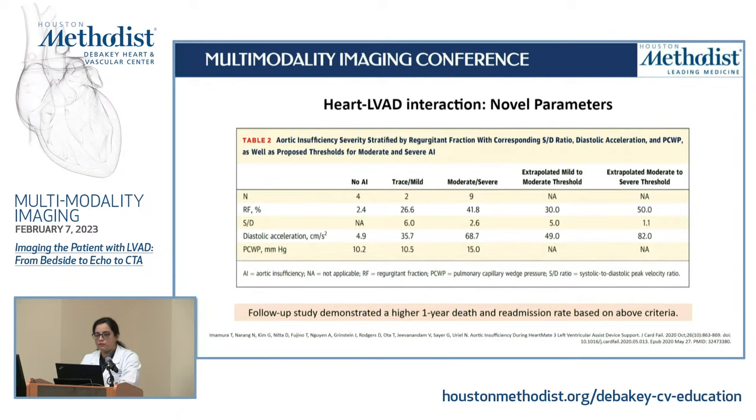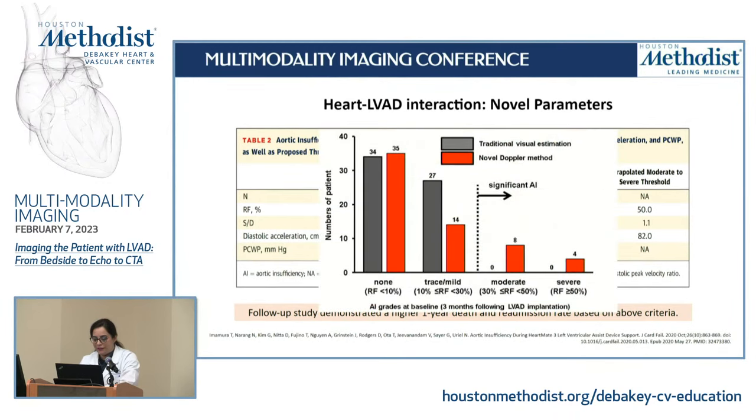Quick question. If with CT you are doing a regurgitant valve area by looking at that orifice, why couldn't we do something similar with a TEE short axis of the aortic valve? We can certainly use that too. Could we do a similar thing? I think so, especially with the newer technology, we've made so many more advancements that that's certainly a possibility. But as a center, systematically, this is an area we could really work on and look into, and we haven't done that, and we should. I think that's important because this is still a very relevant problem.